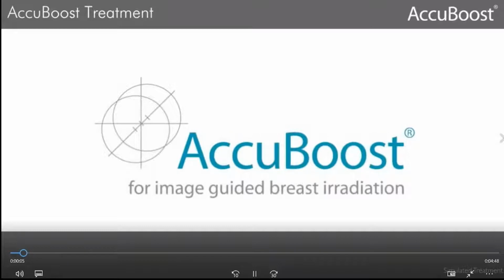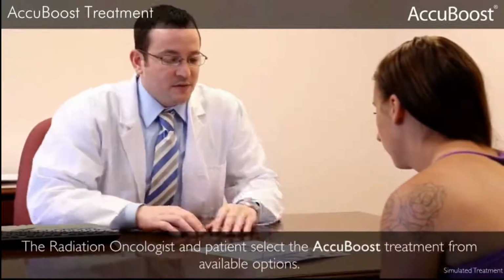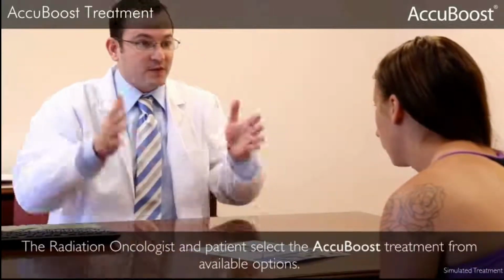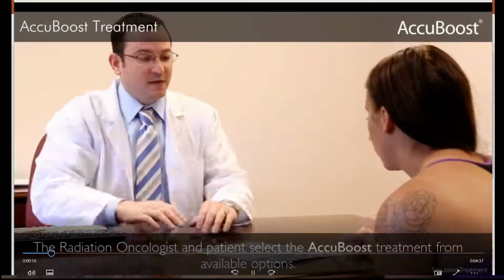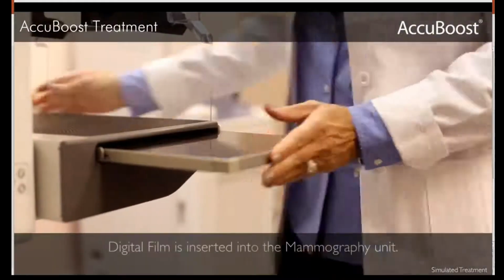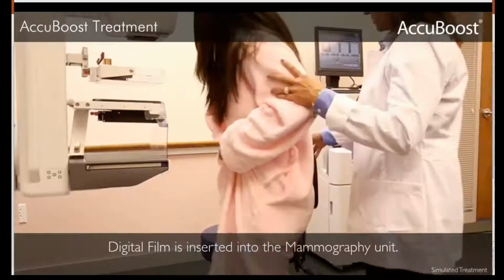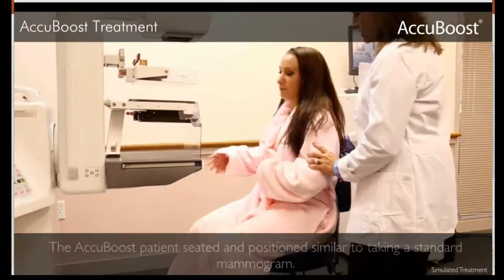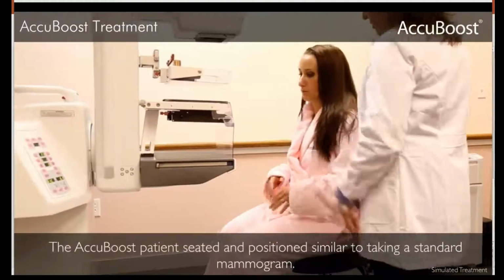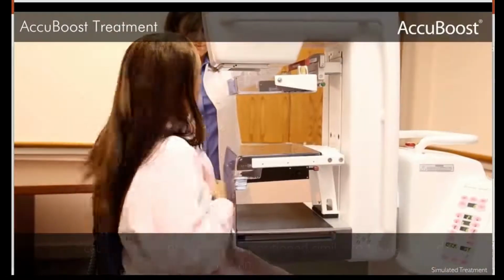The AccuBoost technology typically is begun with a counseling session between the radiation oncologist and the patient to evaluate patients based on their suitability for AccuBoost, and I'll talk about that in the webinar in terms of the criteria that we use. A patient is brought into the treatment room and is positioned as she would be for a mammogram.